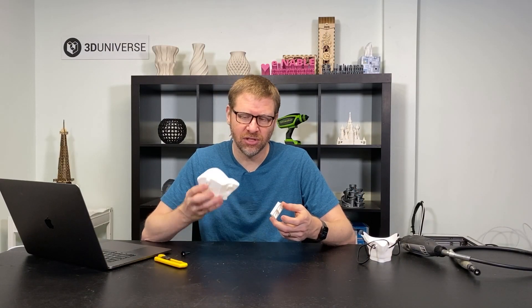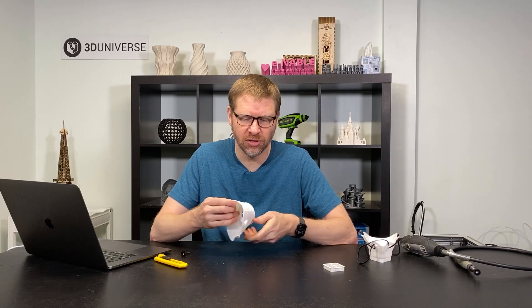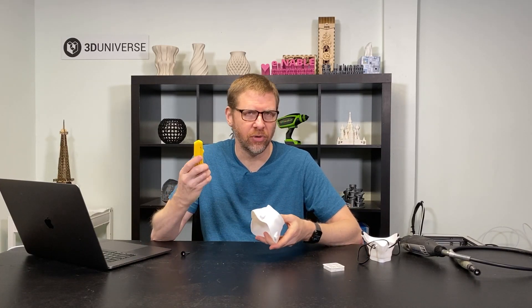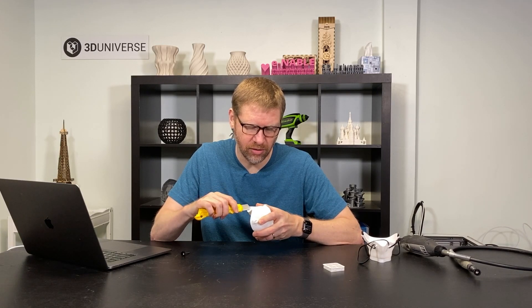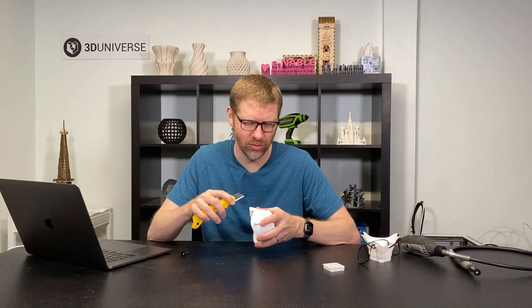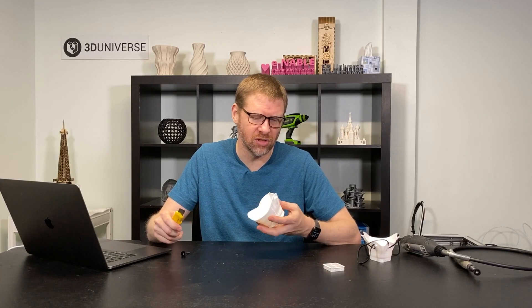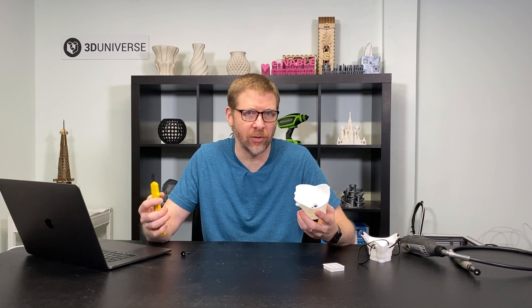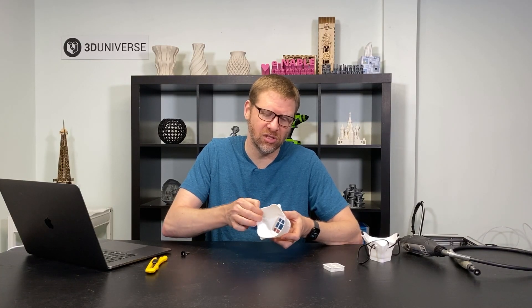Once you have your settings optimized and you get a nice clean print, take a moment to carefully inspect both the outer and inner surfaces. Make sure you don't have any significant defects. You might notice some stringing, especially around the strap connectors — that's pretty easy to clean up. You might want to start with just a razor blade to trim some of those little bits away. It's better to cut them than to pull on them, because pulling tends to leave grooves in the mask. You can also use a heat gun or tools like the Modify 3D Pro, which is basically a little soldering iron with different tips for cleaning up prints.